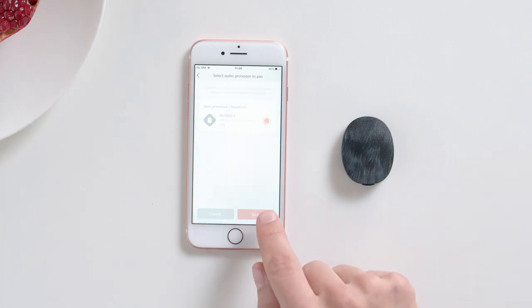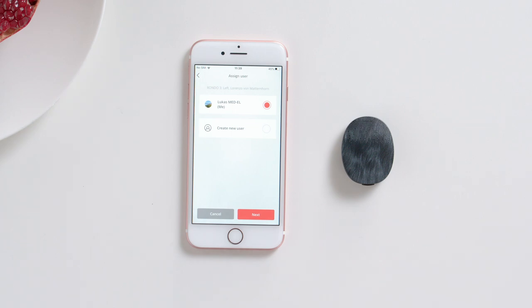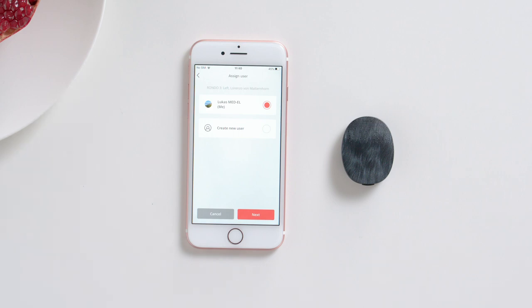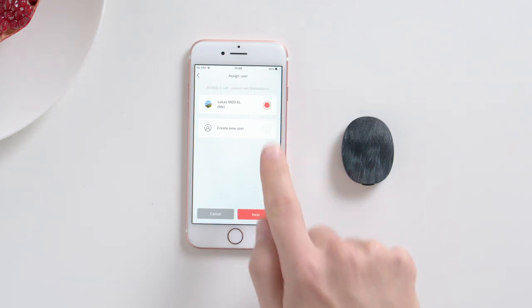Assign a user to the audio processor. If it is your audio processor, select your account and tap Next. If the audio processor belongs to your child or someone you look after, then select the corresponding user from the list.